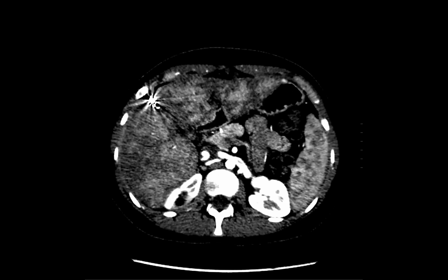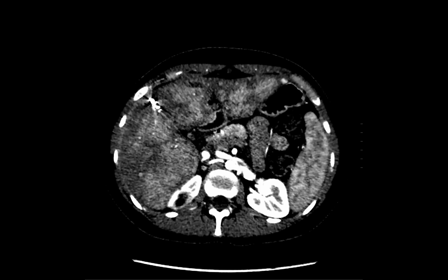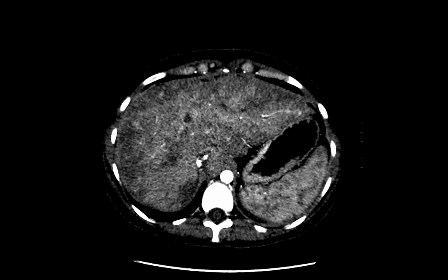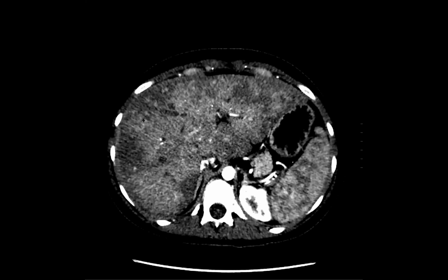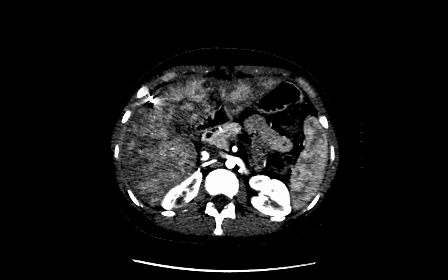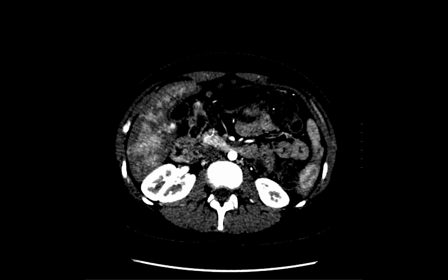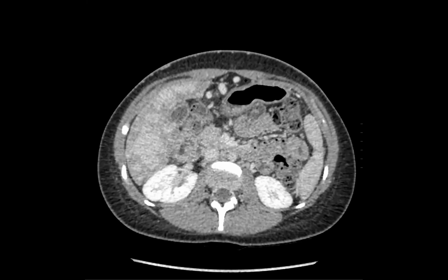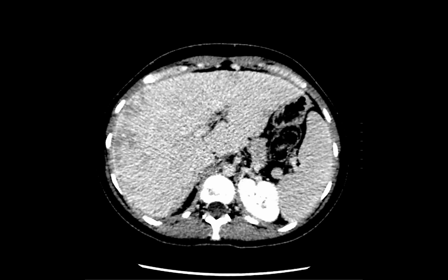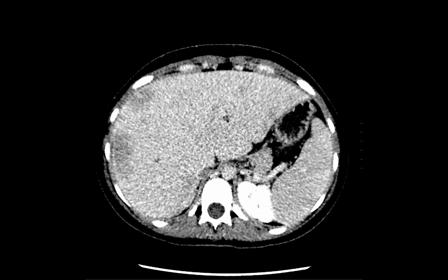And Kedar is writing into the chat nodular hyperplasia. Yes, that's right. That's so right. So I'm showing this case because of the liver lesions. There's all these little small enhancing liver lesions throughout the liver here, and on the venous phase they're isointense. They don't really wash out. And then here's a 5-minute delay. They don't really wash out. So yes, I'm showing this case exactly for that.